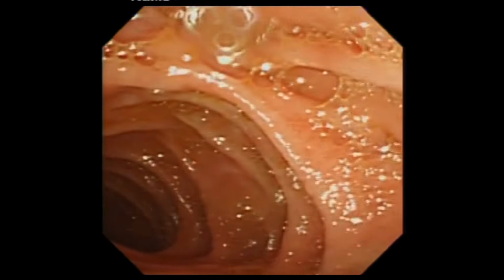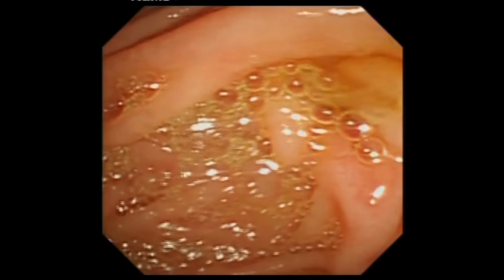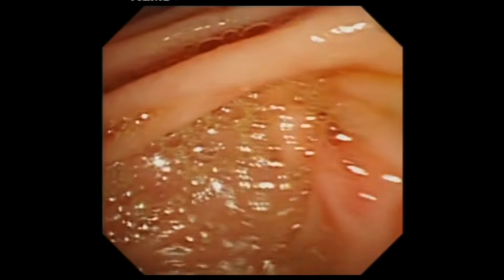So, on side-viewing endoscopy, when we reach the second part of the duodenum, we could clearly see the sphincterotomized papilla there. However, the lower end of the CBD stent was not seen within the duodenum. So, an on-table fluoroscopy was done to rule out any migration of the stent. But on fluoroscopy, we could see that the stent was still present within the CBD.